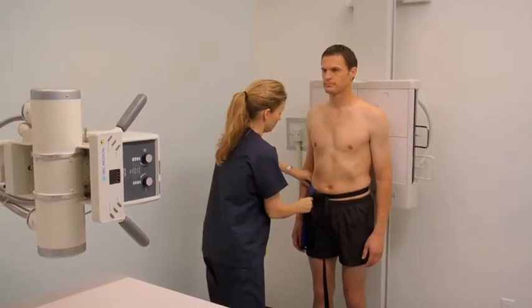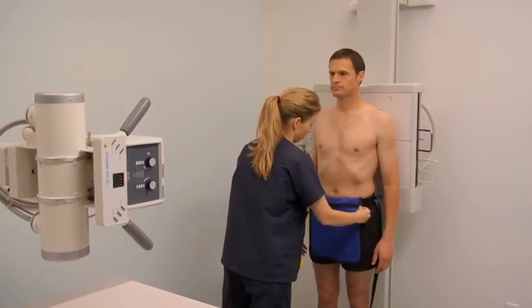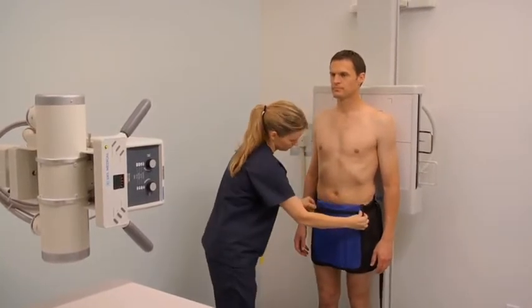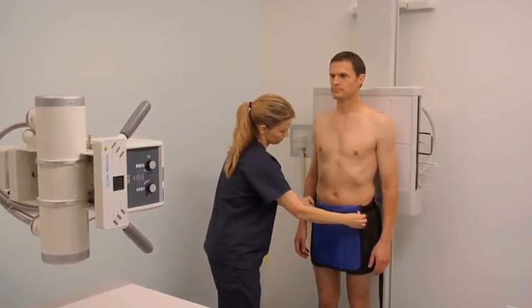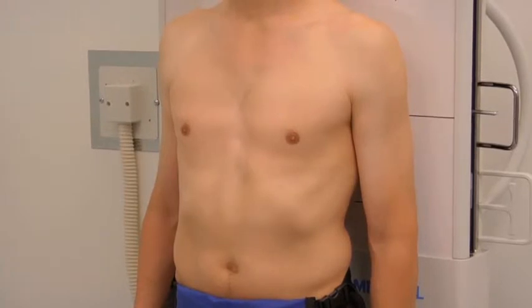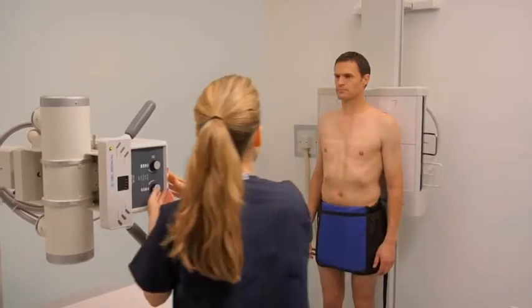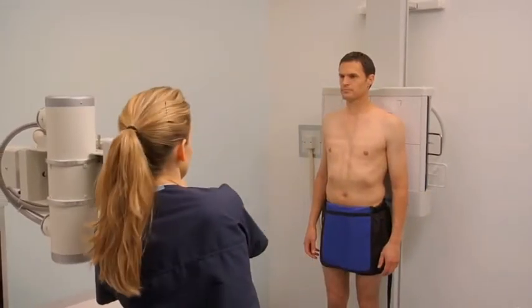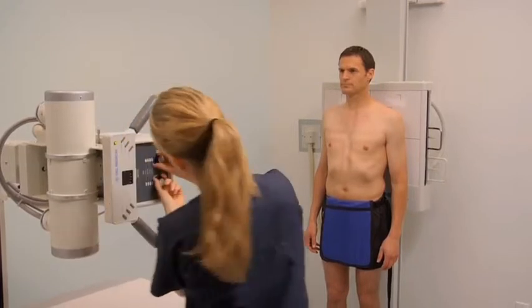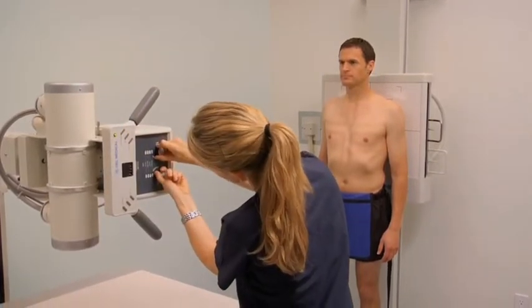Position the lead shield over the patient's reproductive organs and ask the patient to stand with the upper back touching the image receptor. Align the central ray to the level of the 7th thoracic vertebra in the MSP.